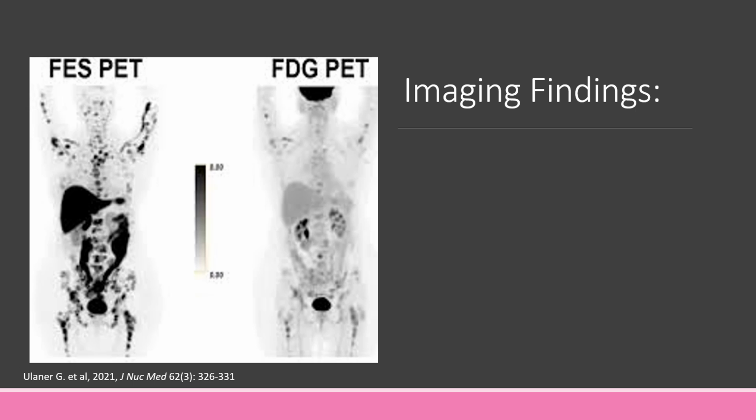This is a case of invasive lobular carcinoma, which demonstrates lower conspicuity for FDG PET than the common invasive ductal carcinoma.